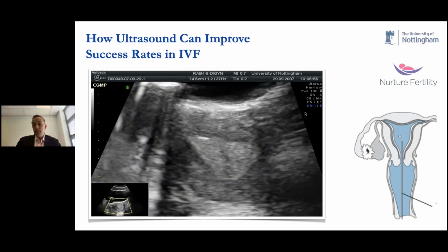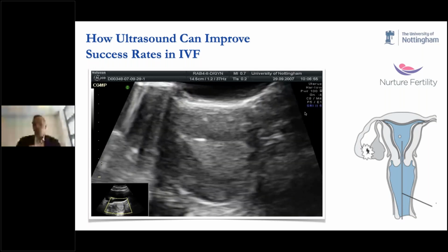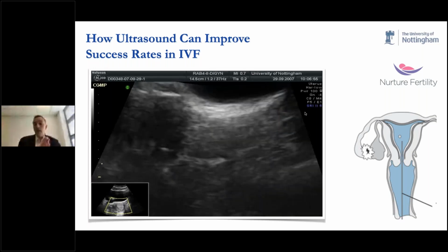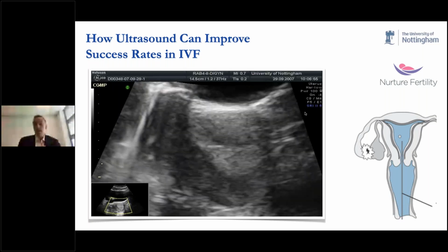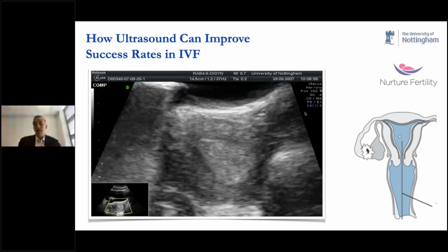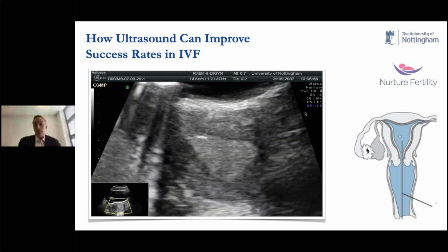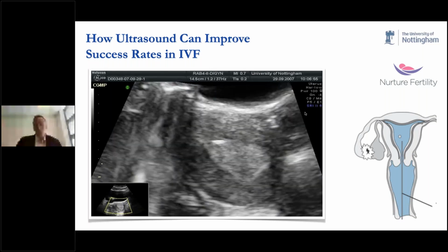No wonder some of these patients end up with ectopic pregnancy, or potentially these embryos are actually expelled while implantation doesn't occur. So we've known for a long time that endometrial contractions may have a negative effect, and there are studies looking at smooth muscle relaxants, such as atosiban and so on, to actually improve success of embryo transfer. But also the question is, why are we getting so many contractions? A lot of it relates to difficult embryo transfers, and that's certainly something you can reduce or improve by using ultrasound to guide your transfer, help you get through the cervix in a simplistic way that causes the least trauma possible.